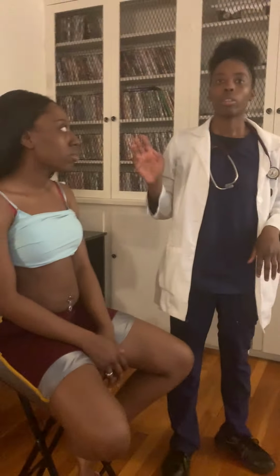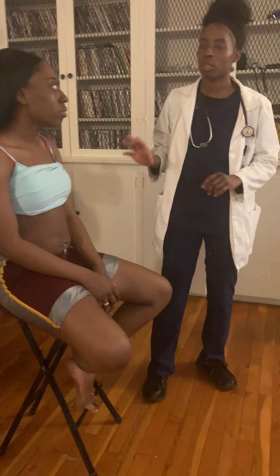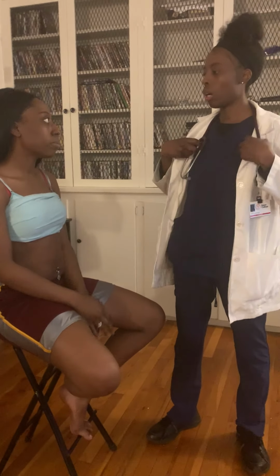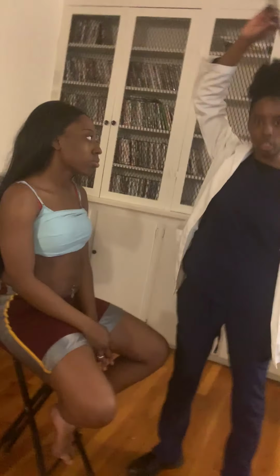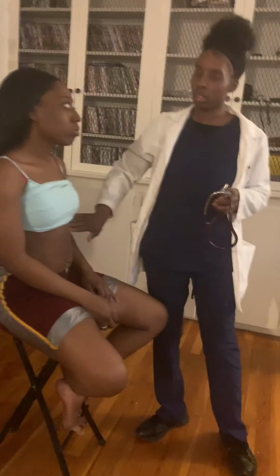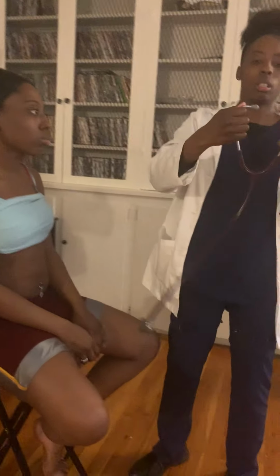Okay. Release. Good. And as I percussed through the anterior chest wall, there were no tympani sounds or dullness sounds, which is good. The anterior chest wall when I percussed was resonant. I didn't hear any crackling or popping at all as I percussed through the anterior chest wall. Now what I'm going to do is auscultate through the anterior chest wall. And as I said earlier, from the apices of the lungs all the way down to the 6th intercostal space.